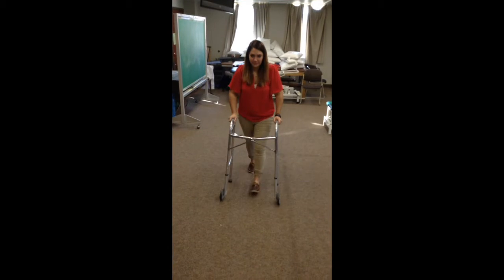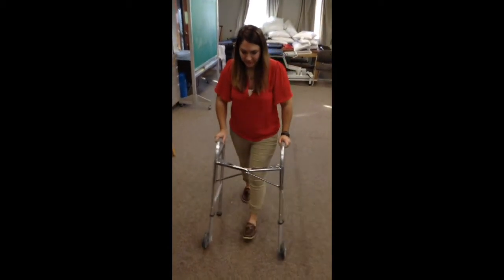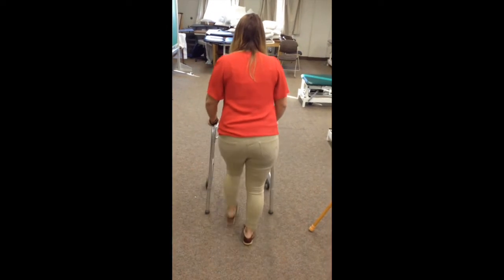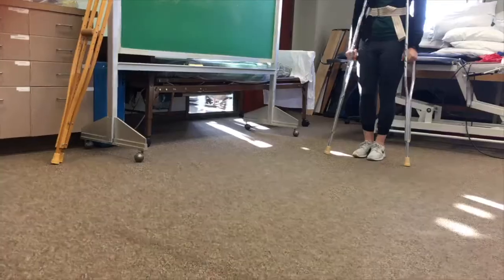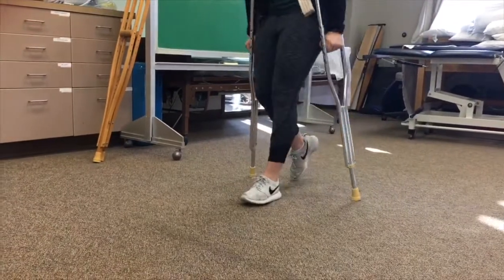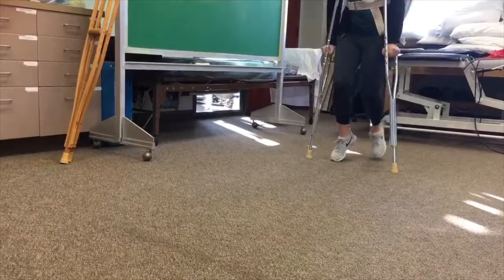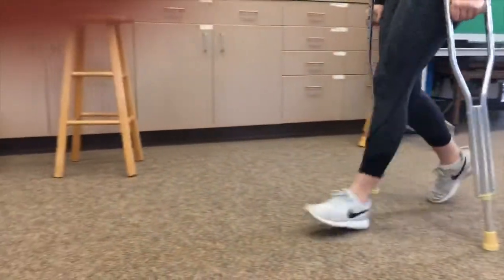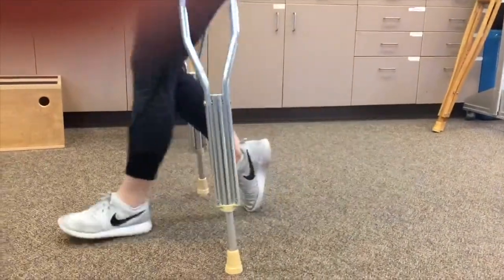A walker is used for significant lower extremity weakness, both unilateral or bilateral, as well as used for a moderate or significant balance impairment. Two crutches are used for less than 50% partial weight bearing, toe touch weight bearing, or non-weight bearing gait. They can also be used for balance impairments and significant lower extremity weakness.